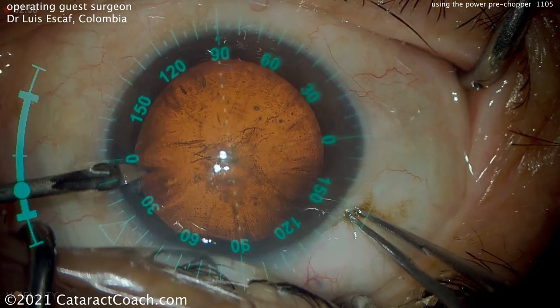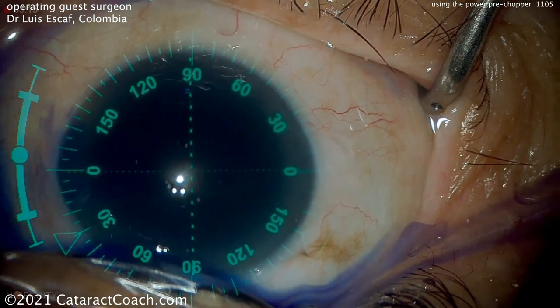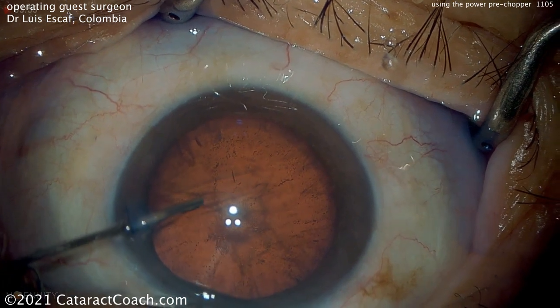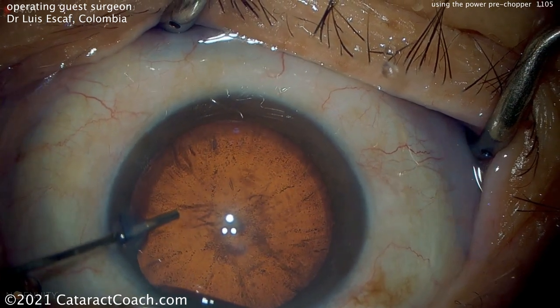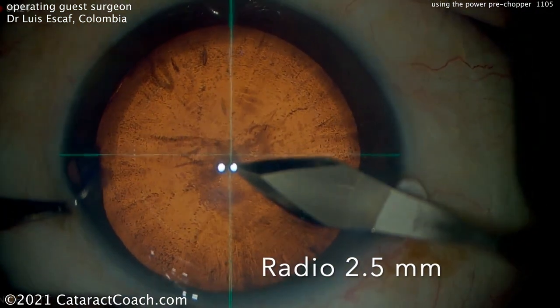So there's the cataract — a lot of posterior subcapsular changes. You notice the video overlay here. Using this 3D heads-up system, he's able to overlay the axes or meridians for astigmatism. And also you can see there's the center of the eye.